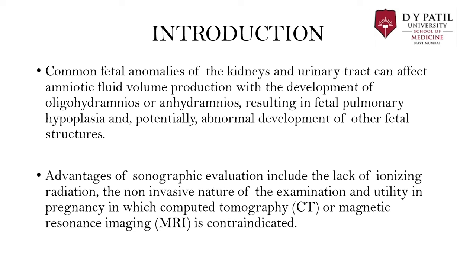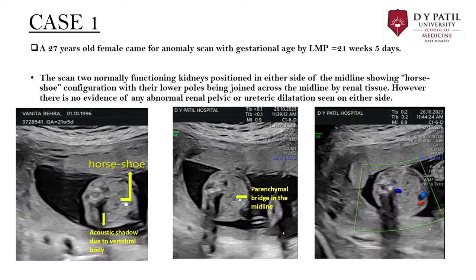We'll be focusing on two important cases. In the first case, a 27-year-old female came for a routine scan with gestational age by LMP being 21 weeks and 5 days. The scan shows two normally functioning kidneys positioned on either side of the midline showing horseshoe configuration, with their lower poles joined across the midline by renal tissue. There is no evidence of any abnormal renal pelvic or ureteric dilatation seen on either side.